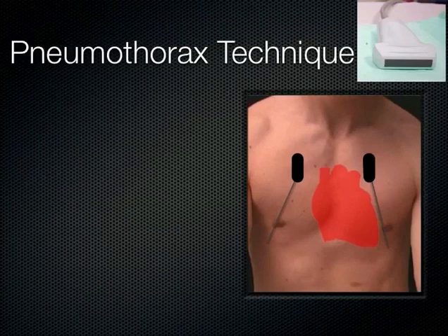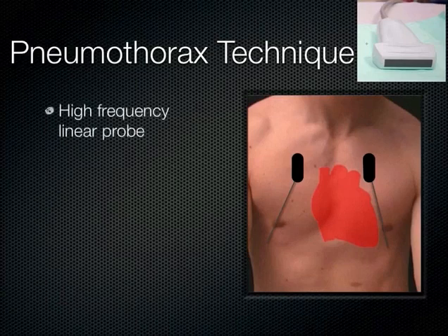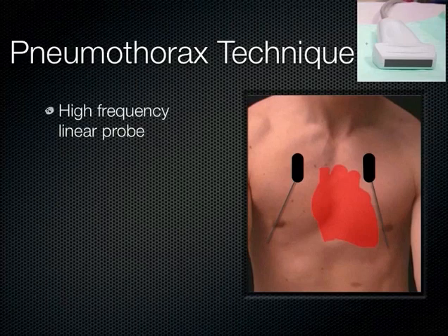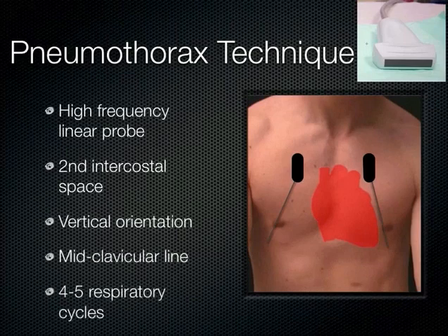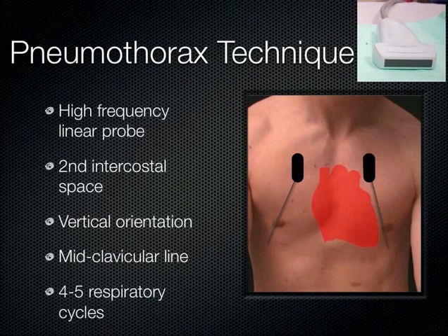Start at the mid-clavicular line using the high-frequency probe, since we're looking very superficially — the pleural line is only a centimeter or two underneath the surface. Start in the second intercostal space with the orientation marker towards the head. Move downwards anteriorly, then laterally to get images in all four quadrants — a little more laterally on the left to avoid the heart. When you put the probe on the patient, watch them breathe through a few respiratory cycles, because you're trying to pick up whether the pleura is moving.